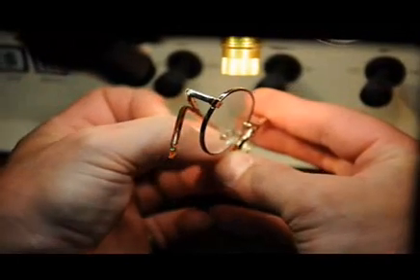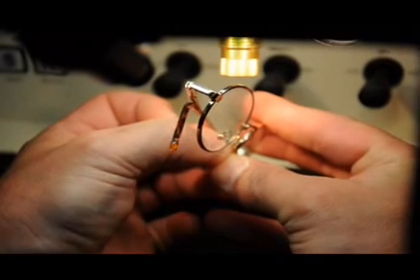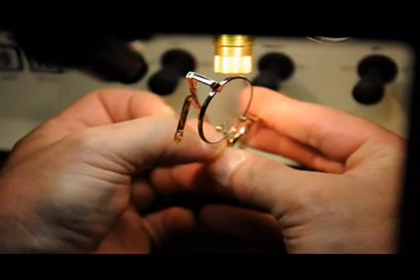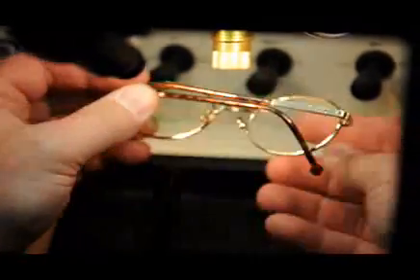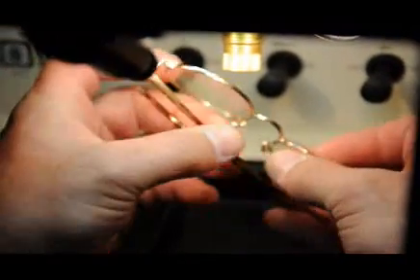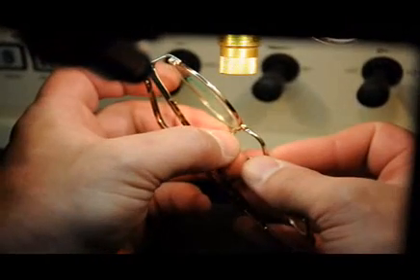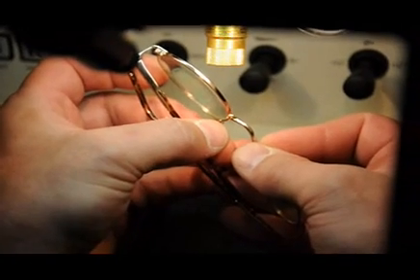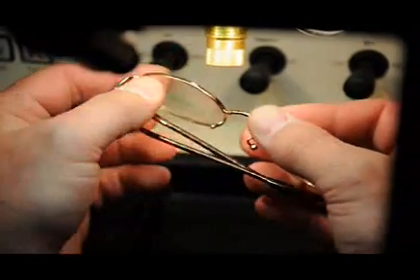The operator introduces the broken nose pad arm to the frame and will tack weld it into place, and then we'll inspect the alignment to ensure that it is correct. We're not welding for strength at this time, we're welding for position.